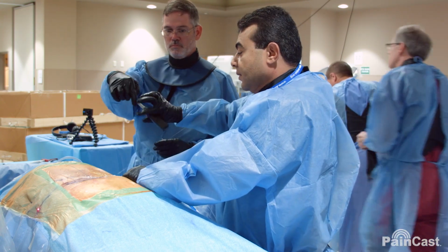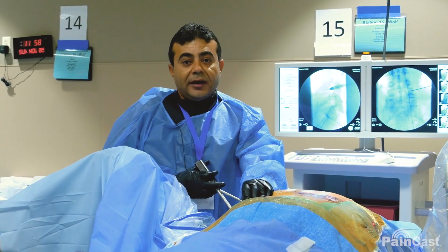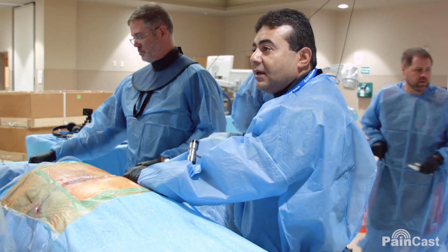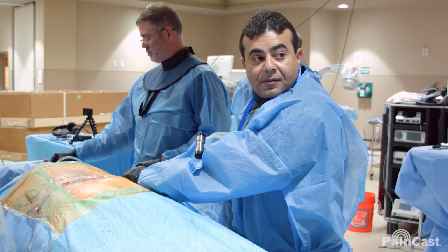I am on a lateral view. I want to make sure, again, on an AP view, that we have not crossed the medial pedicular line. AP in the lateral, please. Okay. It's better squared on.